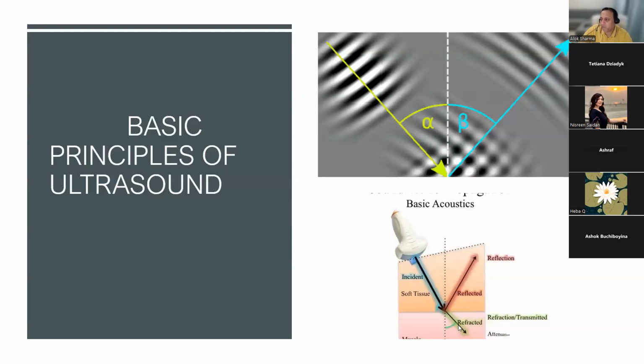But naturally, some waves will then be transmitted because they reflect back. Some of the waves that reflect back move in a direction that's slightly separate to the actual waves coming back to the probe. And really, at the margins, the images may not be as clear as for waves that are incident in a perpendicular fashion and return perpendicular. That will give you the clearest, best elements of the image. The portion of the wave that reflects away will reflect an image area that's not so clear.